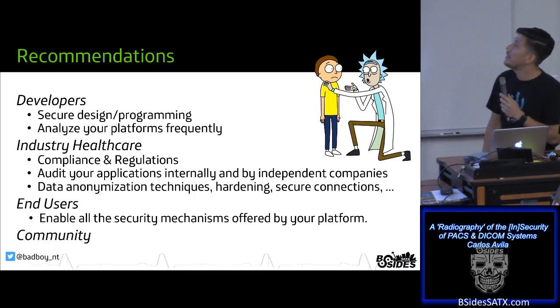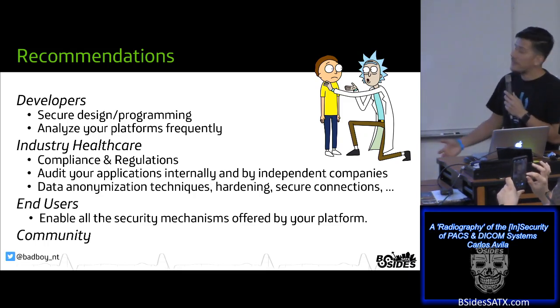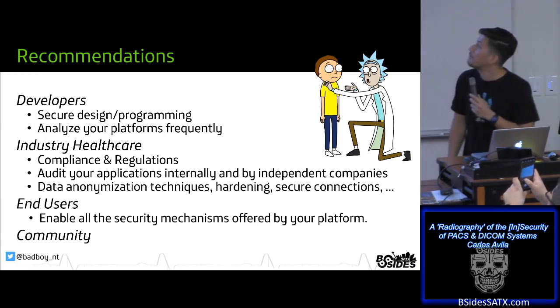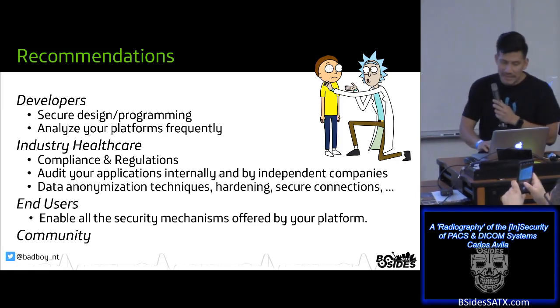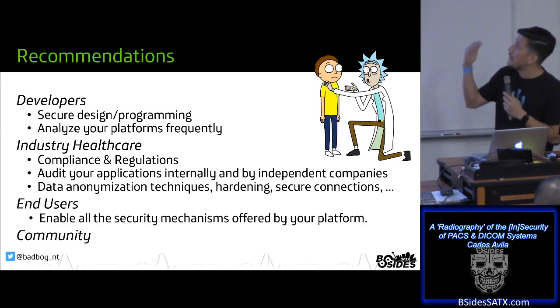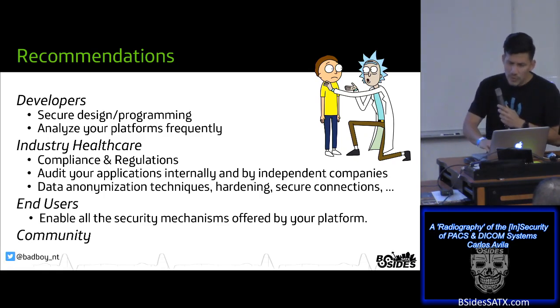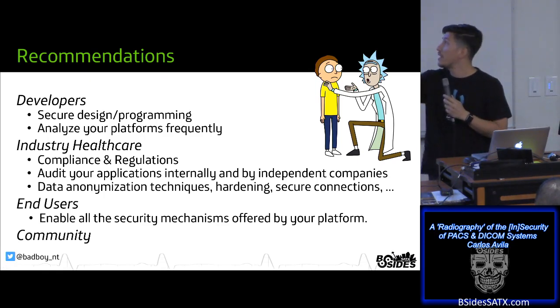Some recommendations. First, developers should develop in a secure way, with secure design. Implement security controls in all stages of software development. Analyze your platforms against industry compliance and regulations, which have a lot of documentation and best practices to implement. After that, audit your applications internally or with an independent company.